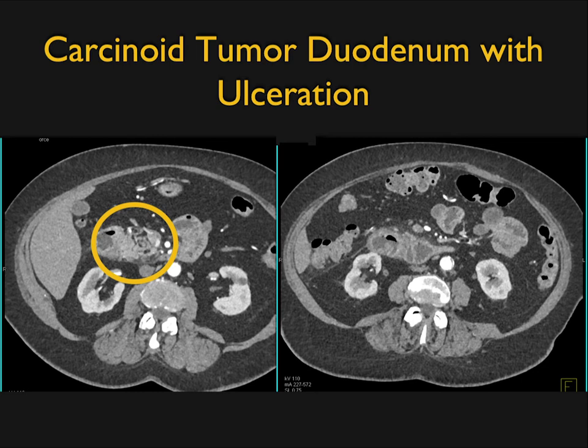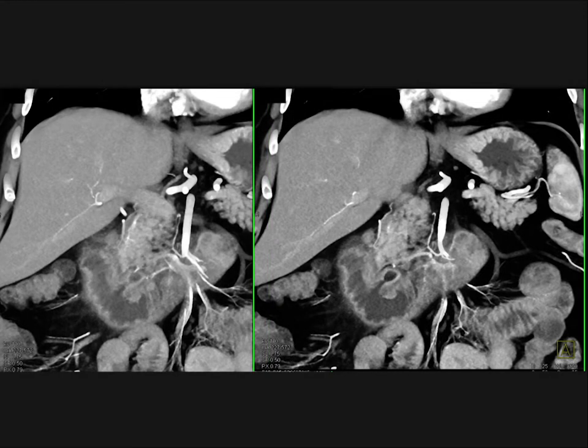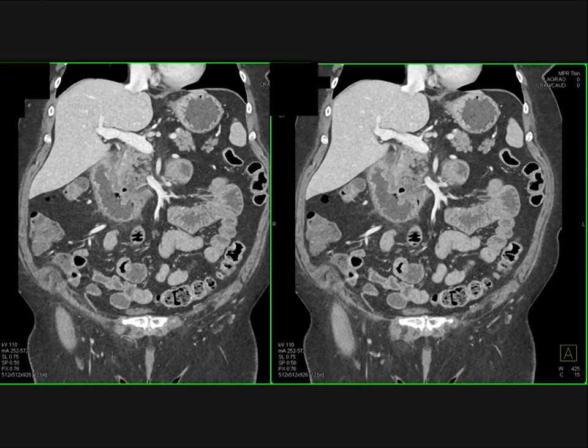I have to admit, if you thought about this tumor, probably you're going to say adenocarcinoma, maybe lymphoma, but likely adenocarcinoma. The tumor is infiltrating the medial wall by the ampulla, extending near pancreas, involving vessels. Very nicely shown. And my first thought in this case, because of its infiltration, the small nodes, is just adenocarcinoma. Adenocarcinoma is still more common than anything else.